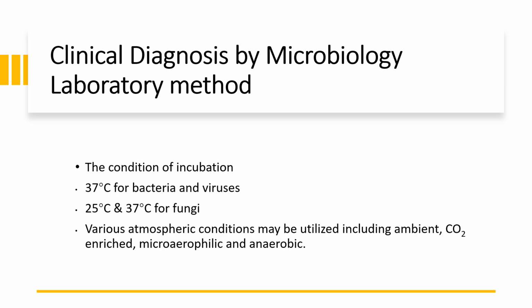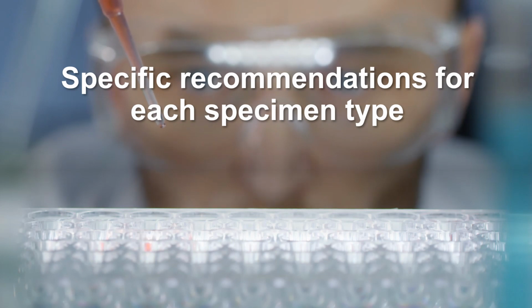The clinical diagnosis of microbiology is also affected by the conditions of incubation. The temperature is 37 degrees Celsius for bacteria and viruses, and 25 and 37 for fungi. Various atmospheric conditions may be utilized, such as a carbon dioxide environment, a microaerophilic environment, or an anaerobic or enriched environment for the microbiology testing. What are the specific recommendations for each specimen type?